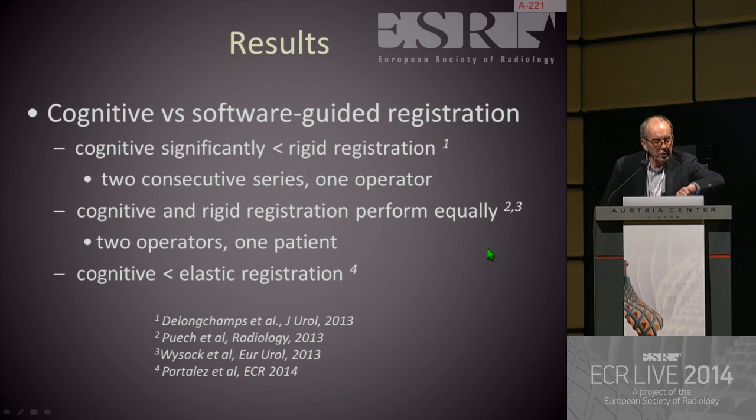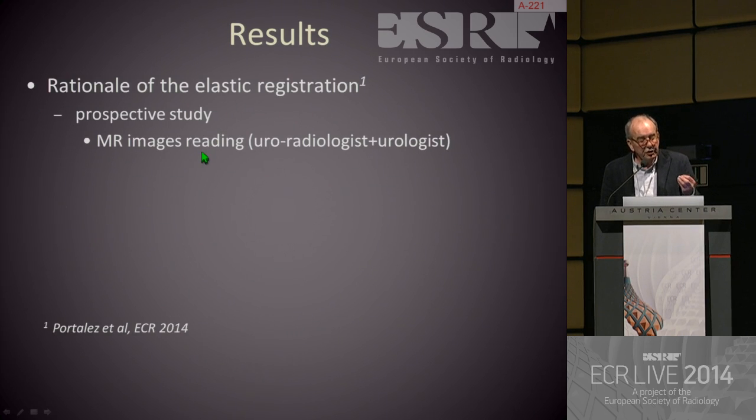But more recent studies reported by Portalez and our group may show that cognitive registration is definitely less effective than elastic registration. This is the prospective study.